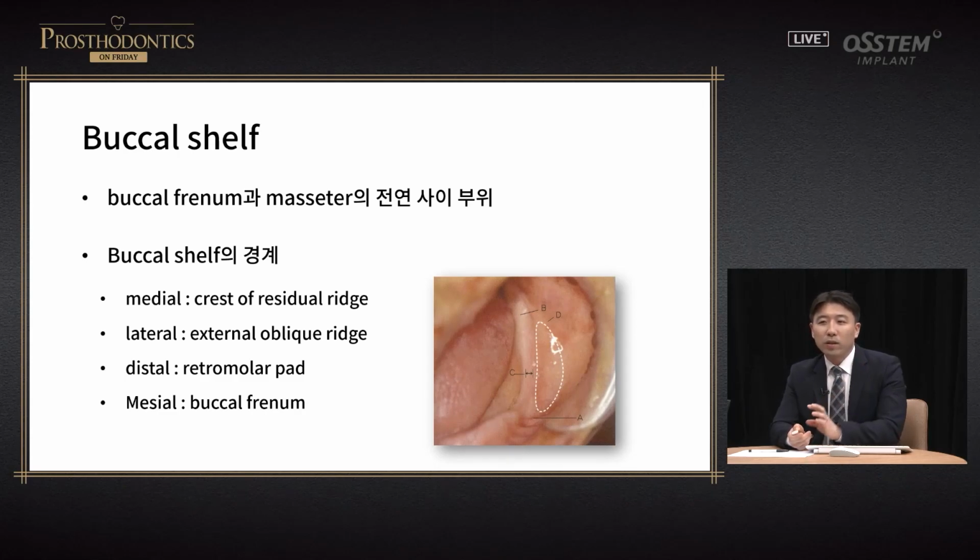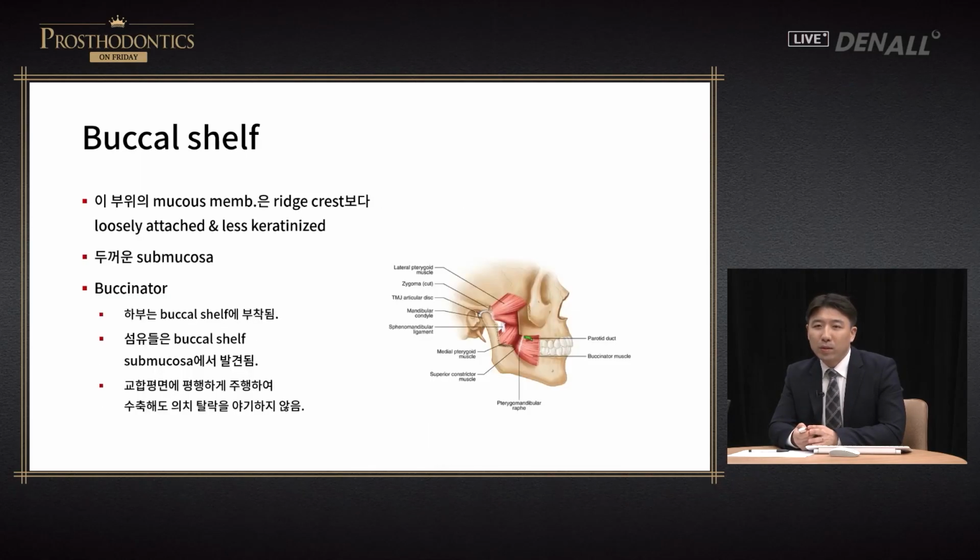When the patient uses the denture and does mastication, this part provides vertical support to withstand occlusion. Therefore, it is a primary stress-bearing area. You need to apply more pressure in that area when taking the impression. If you apply more stress as you take the impression, then you can get a good result. I'm going to talk about this in more detail when I talk about making the tray. Another important point is that this is an area where a lot of change does not occur.